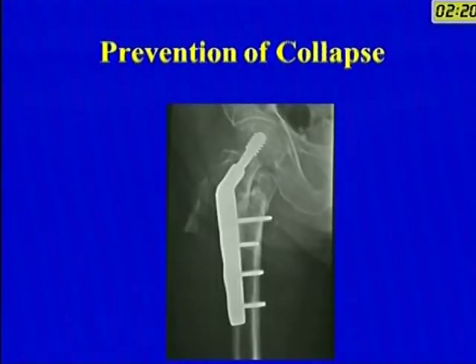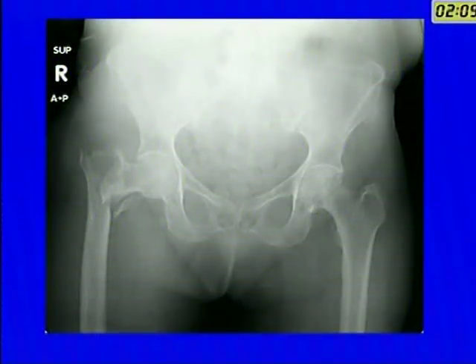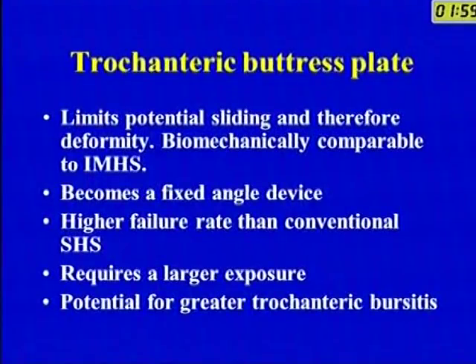So to prevent this collapse, there are multiple things that you can do. One is to use some form of a trochanteric buttress plate, or use an intramedullary nail, or use a fixed angle device. But even a trochanteric buttress plate like this is not always the answer in this particular situation. It has worked well, but it does become a fixed angle device.